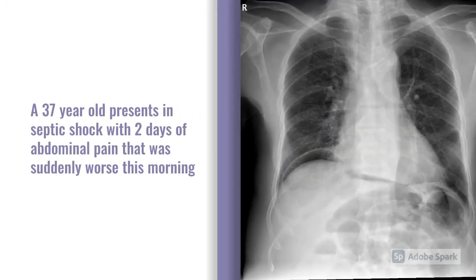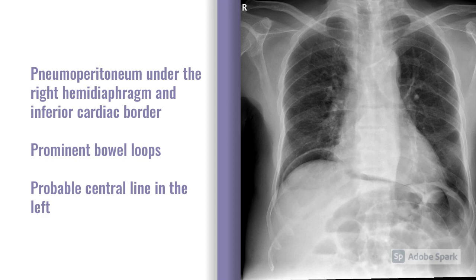Next: a 37-year-old presenting in septic shock with a two-day history of abdominal pain that was suddenly worse this morning. Rotation appears good, inspiration is adequate, and exposure is good. Breathing-wise, the lungs look relatively clear with a few slightly prominent hilar aspects — possibly lymph nodes. Circulation-wise, the heart looks okay, though the right border isn't as crisp. On D, the obvious abnormality is air under the right hemi-diaphragm, and air also tracks to the inferior aspect of the cardiac border. Below the diaphragm, there are also prominent bowel loops suggesting a small degree of obstruction. There is also a line entering from the left side of the neck sitting just above the carina — probably a central line. The diagnosis is a likely perforated bowel requiring urgent surgical input.